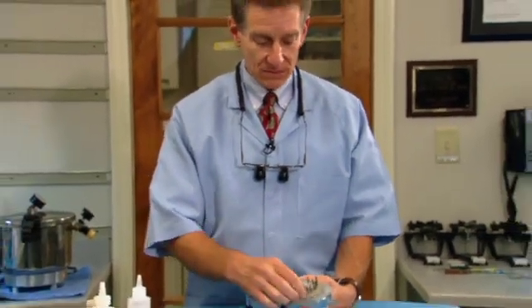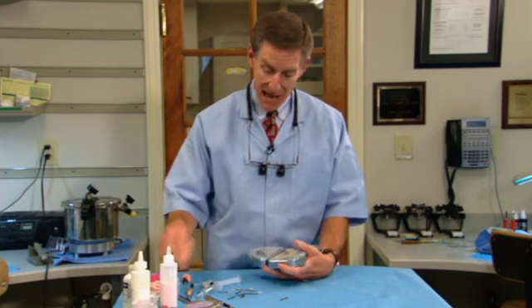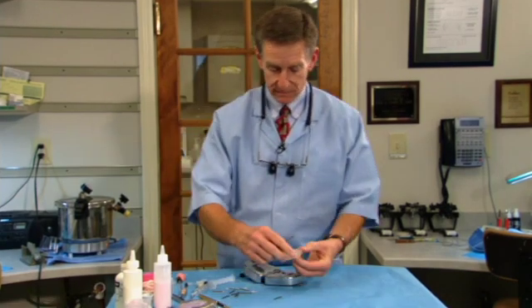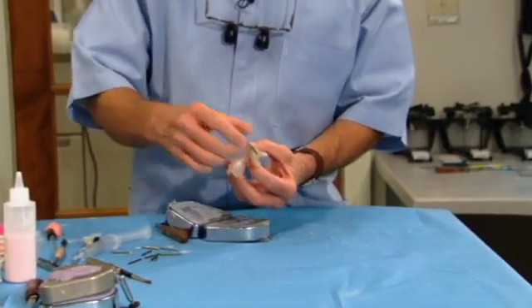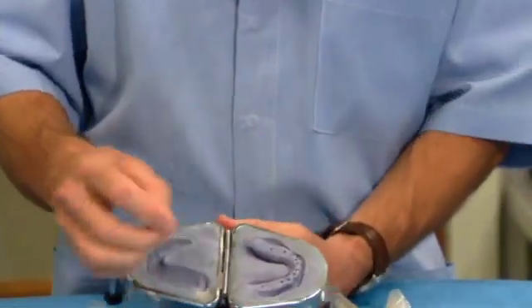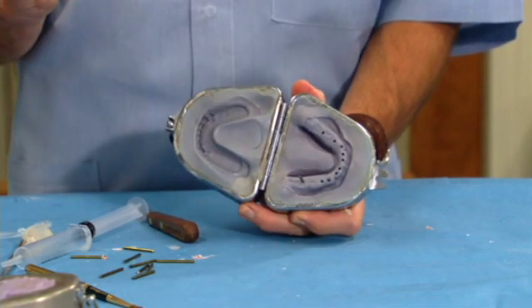The other thing I can do is take this clear duplicate denture to Miss Patel's mouth when I'm ready to place my implants, and for the pilot hole that I'm going to drill, I will use the clear duplicate to punch the original hole. It will give me the exact inclination because we have the bite blocks. The other thing you'll notice is on the putty where the implant can go after I've taken the clear off. This is excellent.